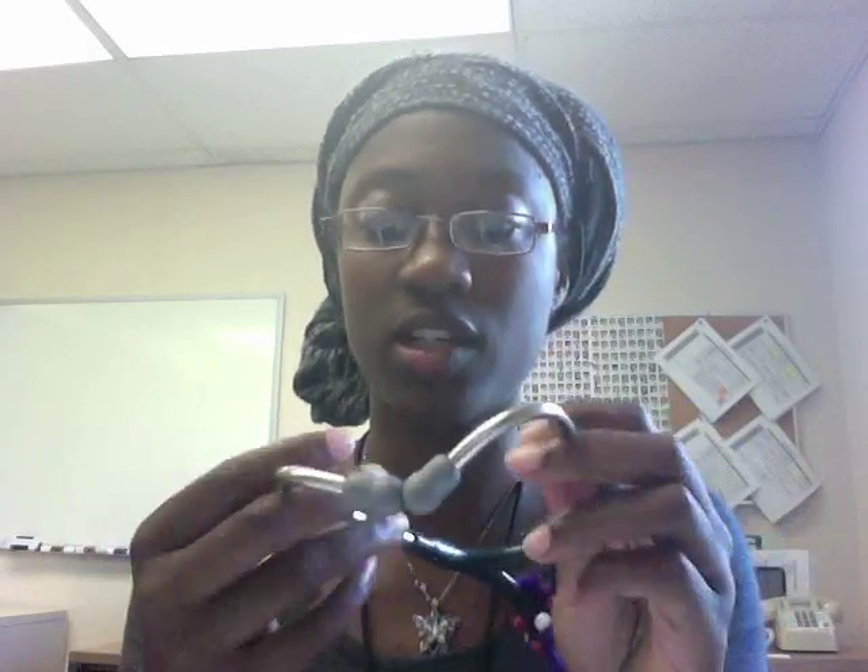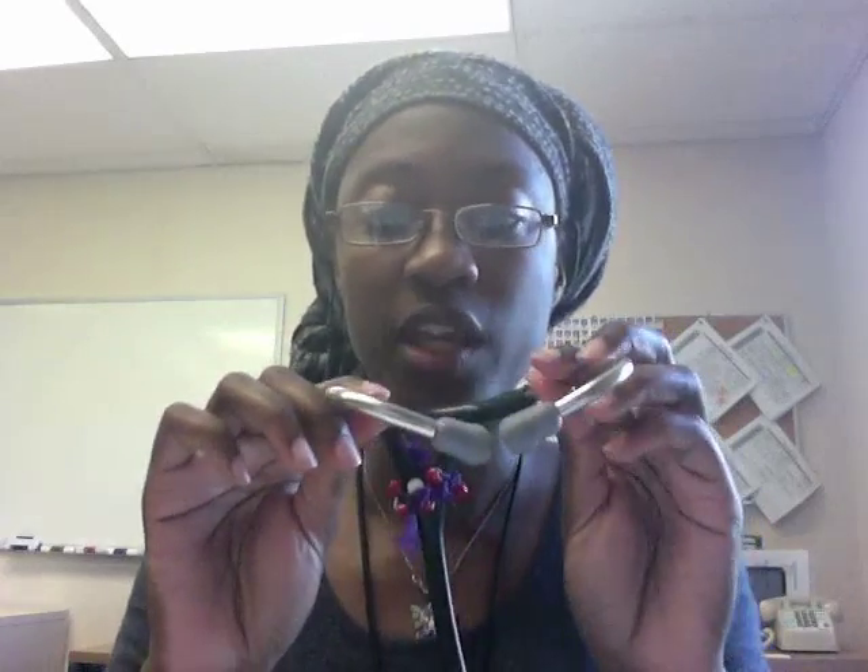Another important piece is knowing how the stethoscope goes into the ears. There are two ways of putting the stethoscope in — one is wrong and one is correct. Your ear canals are facing relatively forward, so when you put your stethoscope in, make sure your earpieces are also facing relatively forward, pointing towards your nose. If you put them in backwards, you won't be able to hear anything and you'll think something is wrong with your stethoscope.